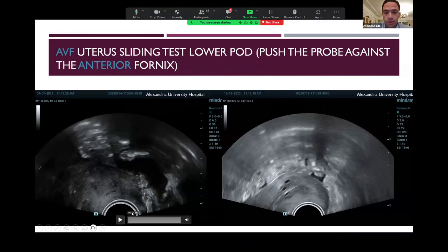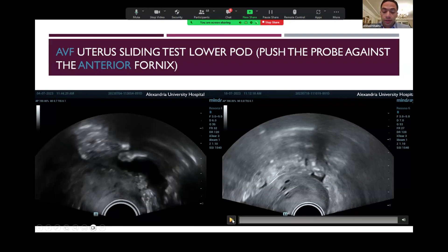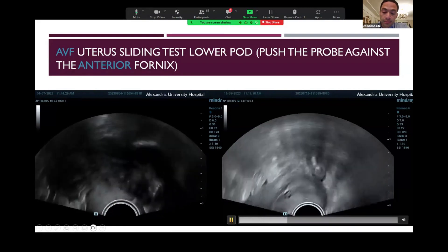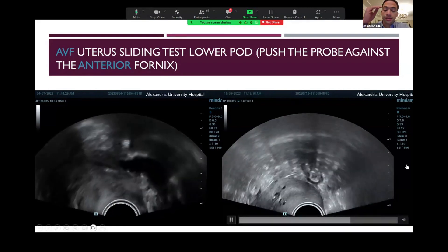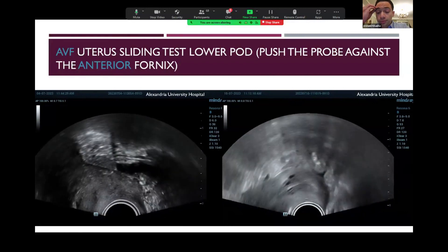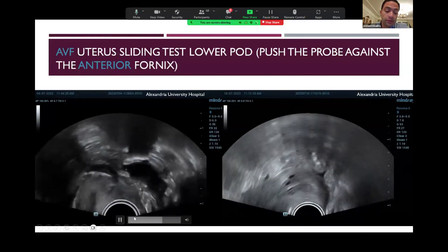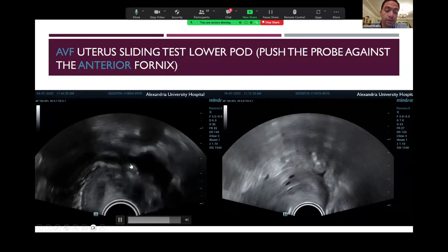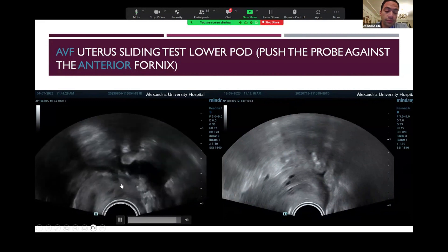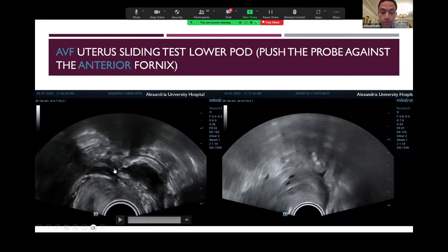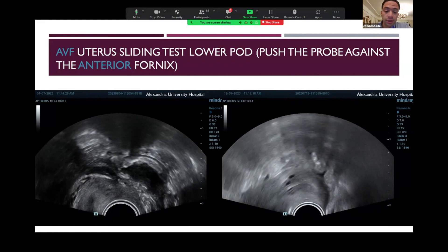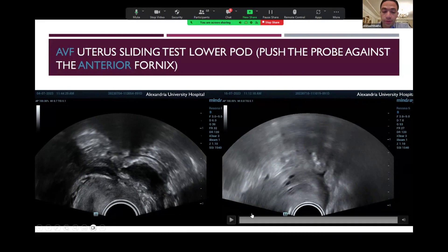We will shift to the pouch of Douglas by pushing the probe against the anterior fornix in cases of AVF uterus. In an AVF uterus, we place the probe into the anterior fornix and press gently against the uterus. The right clip shows free movement of the uterus against the bowel, while in the left clip we can see multiple structures adhered to the back of the cervix and uterus. Once we find a negative sliding test, this raises the possibility that the patient may be suffering from deep endometriosis.